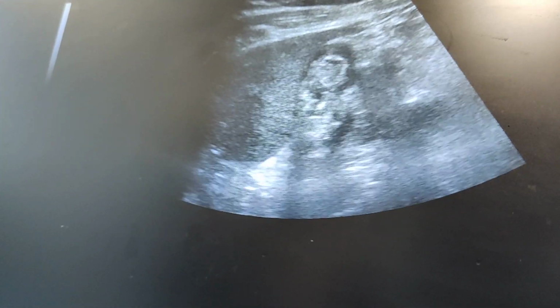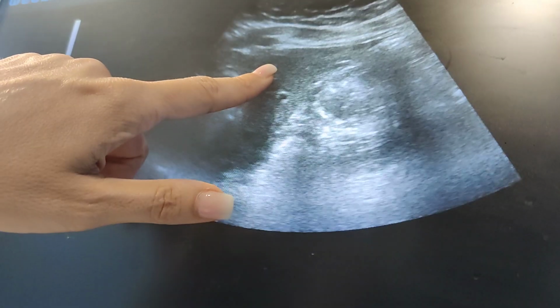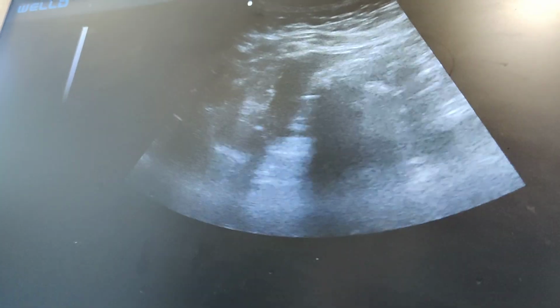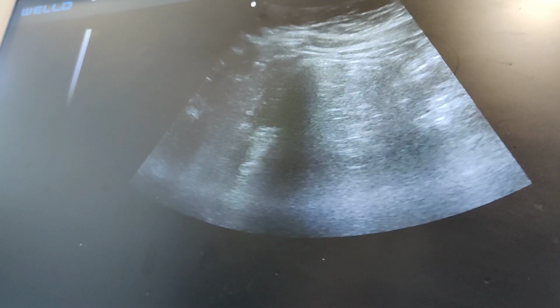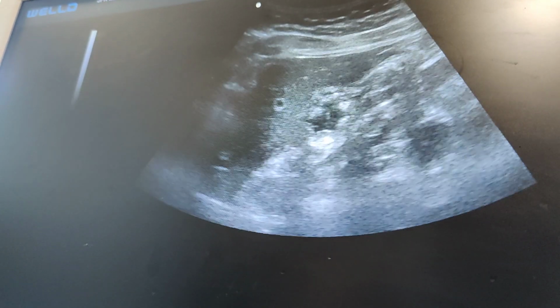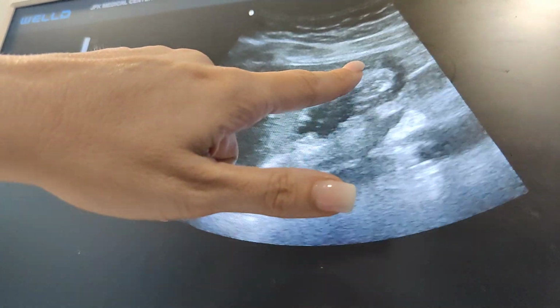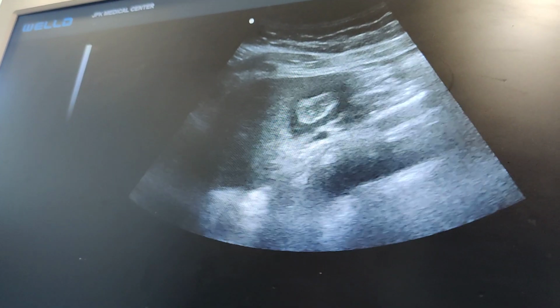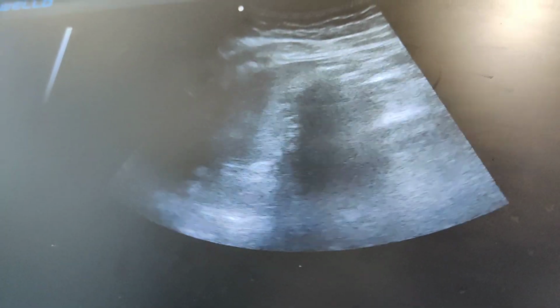When evaluating the liver, you can have your patient take in a breath. And so I can actually see the entire segment of the left lobe of the liver here. You want to be sure you sweep out all the way towards the spleen with your probe in the long position. And this is all from the epigastric area. So I want to look at the edge of the liver. Breathe. All right, take a deep breath in again.